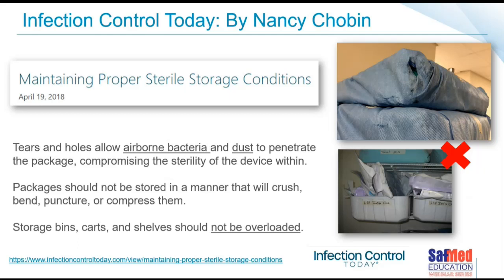Right, continuing with our article with direct quotes, tears and holes allow airborne bacteria and dust to penetrate the package, compromising the sterility of the device within. Packages should not be stored in a manner that they will crush, bend, puncture, or compress them. Storage bins, carts, and shelves should not be overloaded.